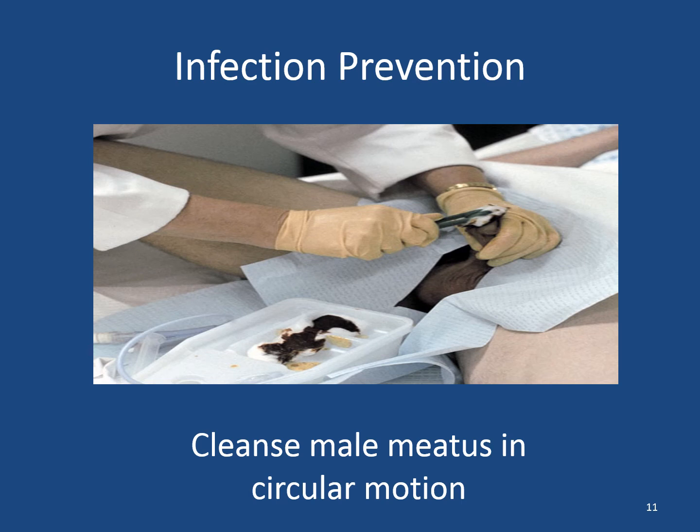If a client has a foreskin, it must be retracted for cleaning and replaced when the procedure is completed. Otherwise, you can cause severe skin and tissue damage, including swelling and edema and pain for the client. You would want to, again, make sure that you hold the penis perpendicular to straighten the urethra when we're placing it.